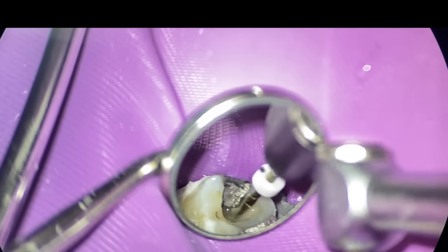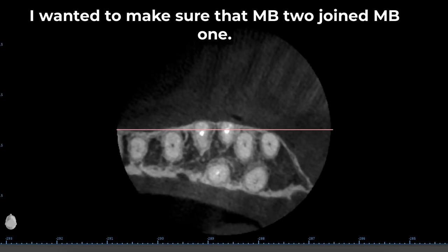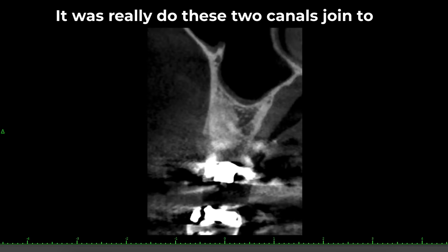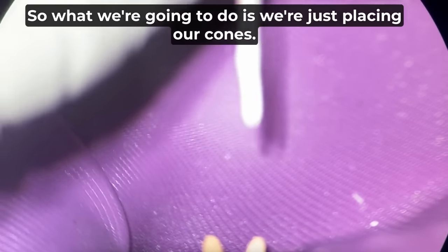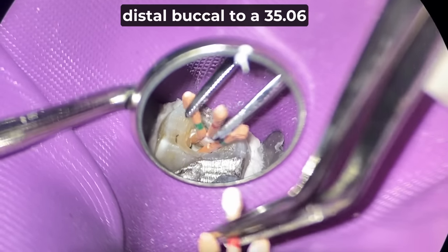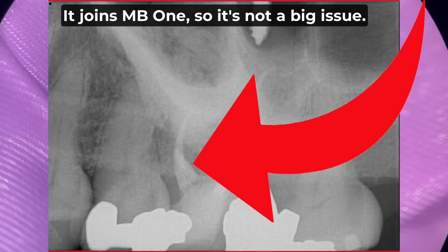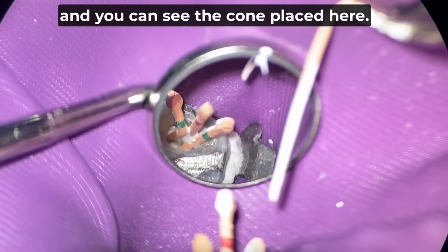In between, interestingly enough, we got a cone beam for this case because I wanted to make sure that MB2 joined MB1. I didn't get the cone beam to help with finding MB2. It was really to check whether these two canals join, to make sure we've got everything. So we're placing our cones. We opened the distal buccal and mesial buccal to a 35/06. We kept MB2 at just a 25/07. It joins MB1, so it's not a big issue. Then we opened the palatal canal to a 45/05, and you can see the cone placed here.